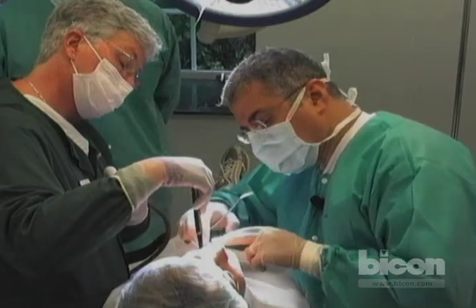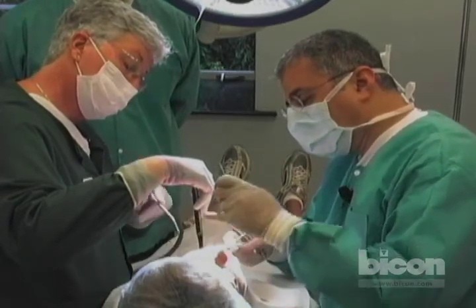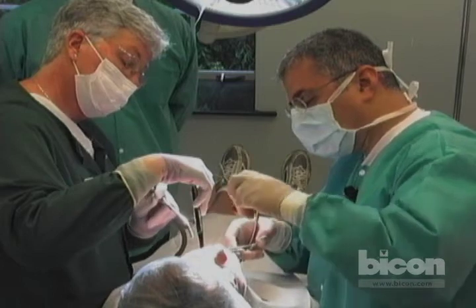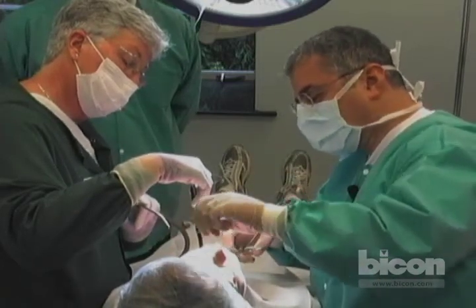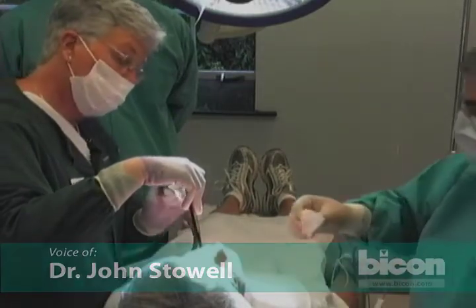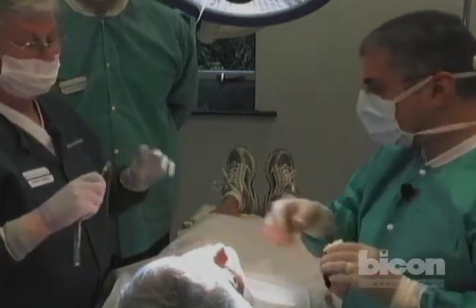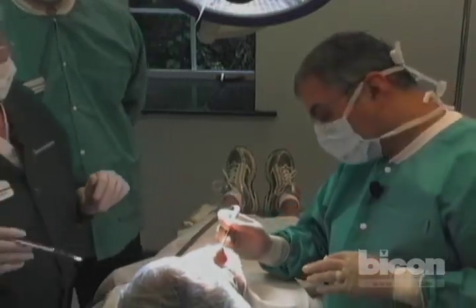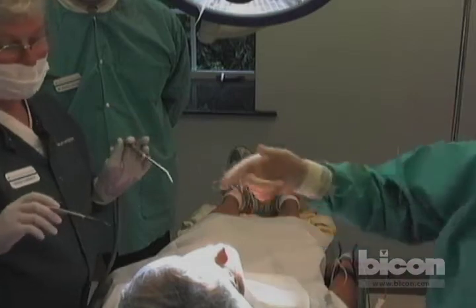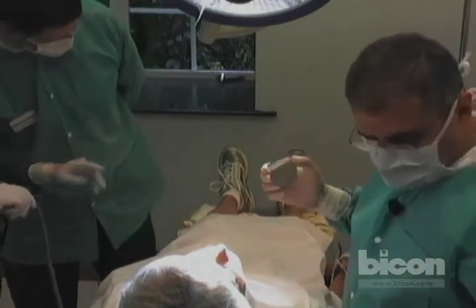We are going to quickly take a periapical x-ray, and if the patient is able to walk, we'll get a panorex shortly. Question: What's your rate of infection with this technique? We haven't had an infection in years with any sinus lifts, much less with this technique — slim to none. The patient is pre-medicated and placed on an antibiotic for a minimum of five days. I think it's equivalent to any oral surgery from wisdom teeth and on.